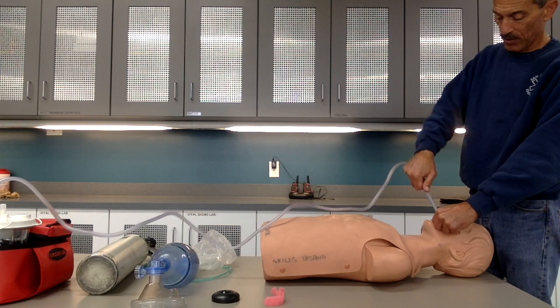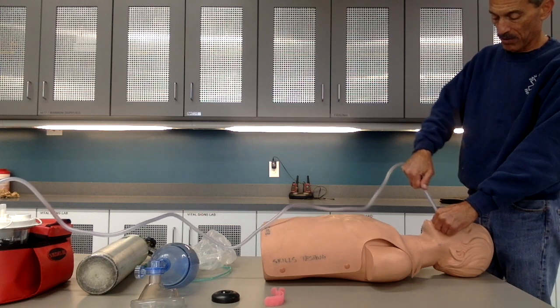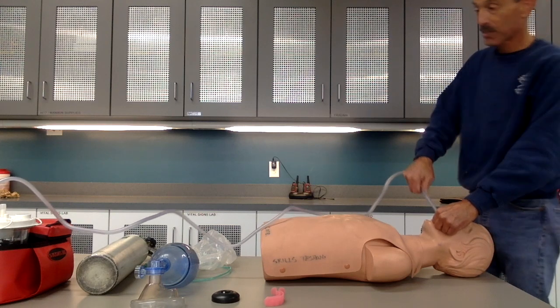One one thousand, two one thousand, three one thousand, four one thousand, five one thousand. Airway's clear of secretions.